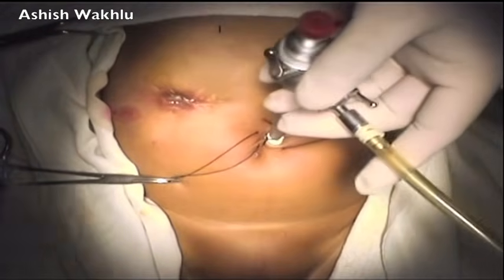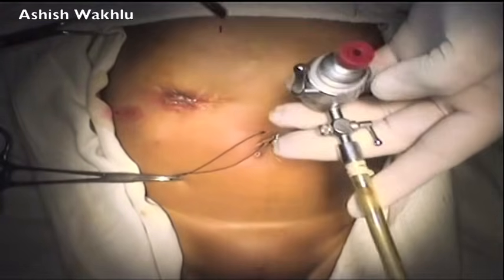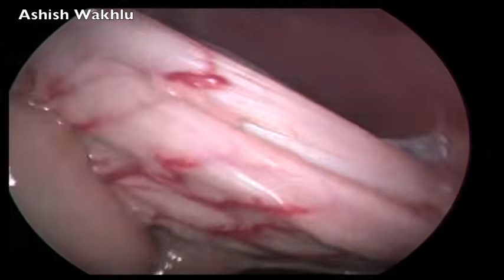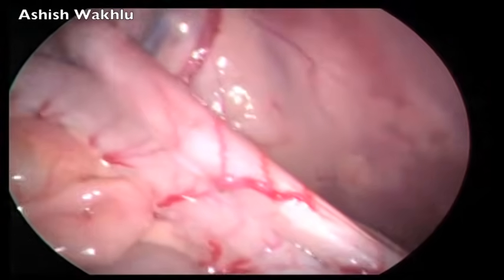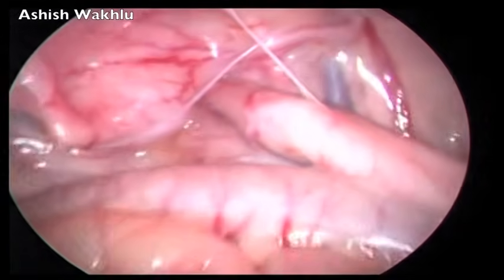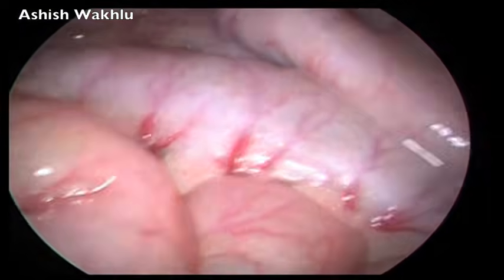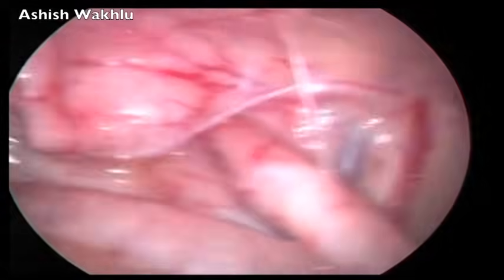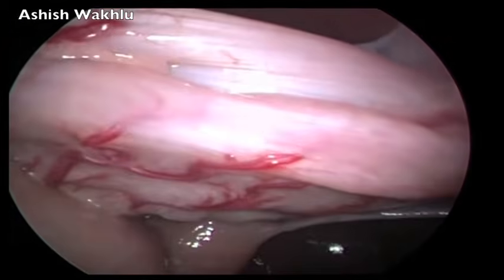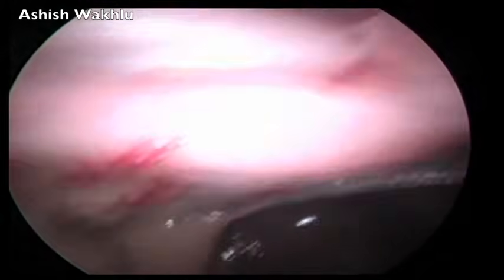This was connected to the CO2 line and a 5 mm 30-degree telescope inserted, which showed the sigmoid colon extending from the pelvis at the site of the fistula up to the colostomy in the right hypochondrium.